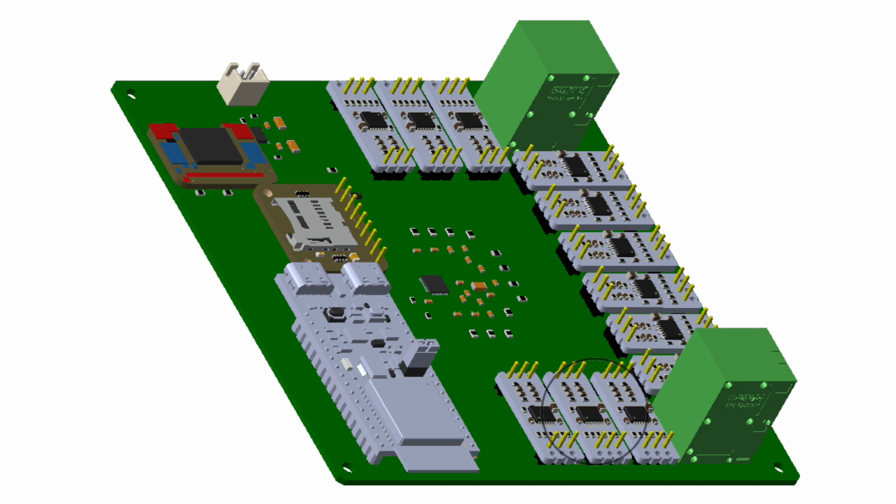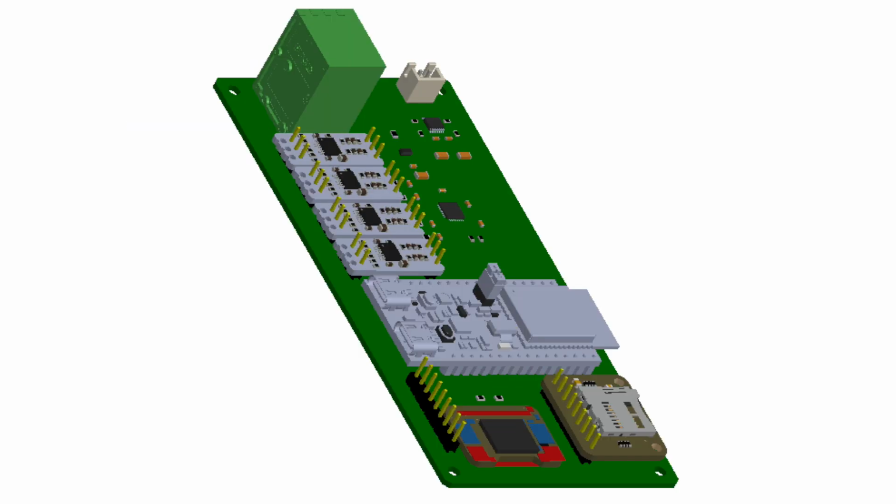Following amplification, anti-aliasing filters are applied to reduce noise and prevent aliasing of the signal. The analog signals are then sampled by an onboard ADC module, which converts them into digital form. These digital signals are transmitted via SPI to an ESP32 microcontroller for real-time processing. Upon completion of the trial, the ESP32 transmits the recorded data over Bluetooth to a custom user interface for visualization and storage. The EMG PCB shown incorporates the same core technologies as the EEG PCB, but has fewer input channels, resulting in a more compact design.